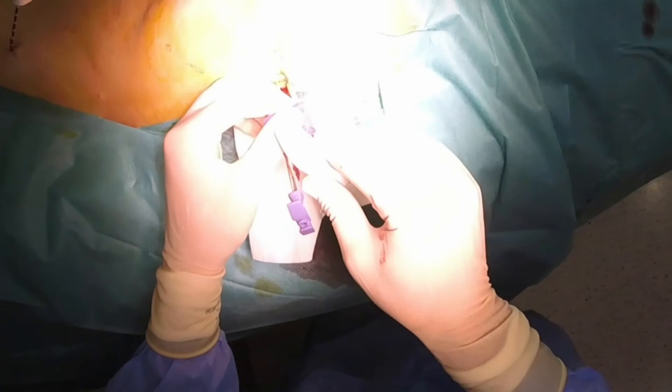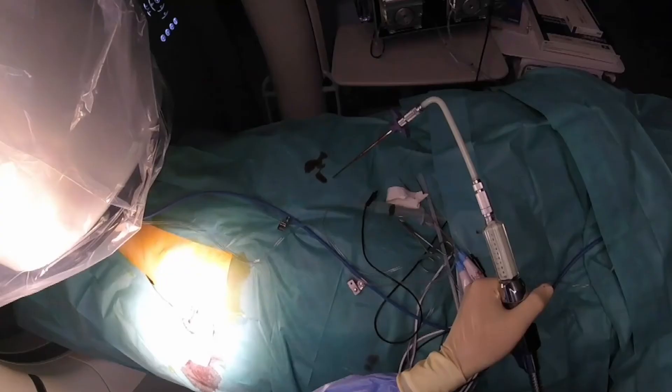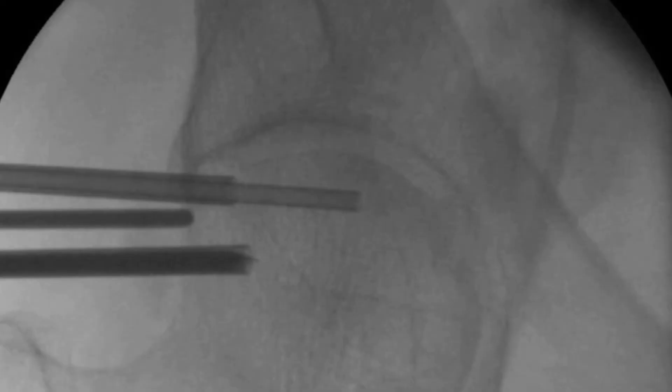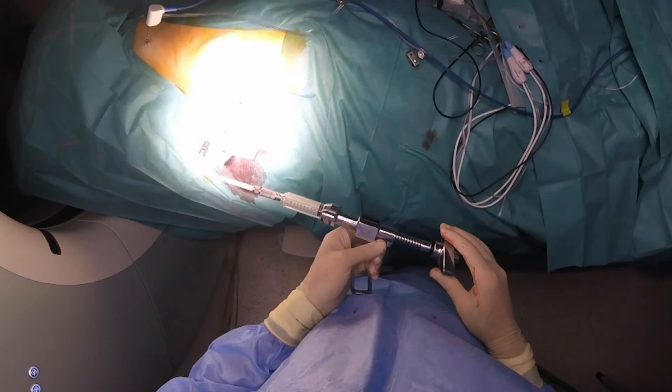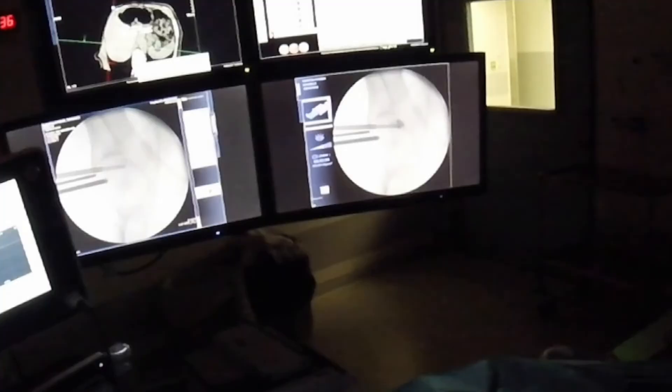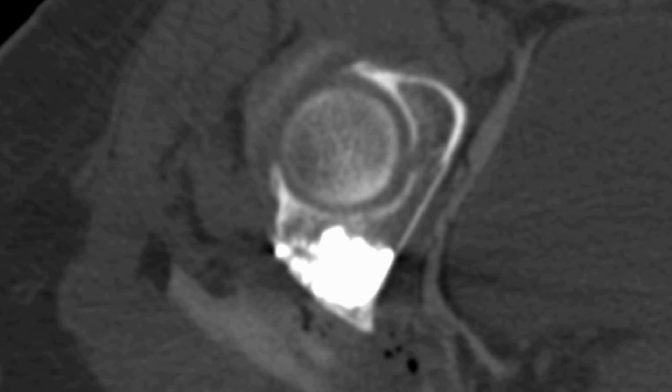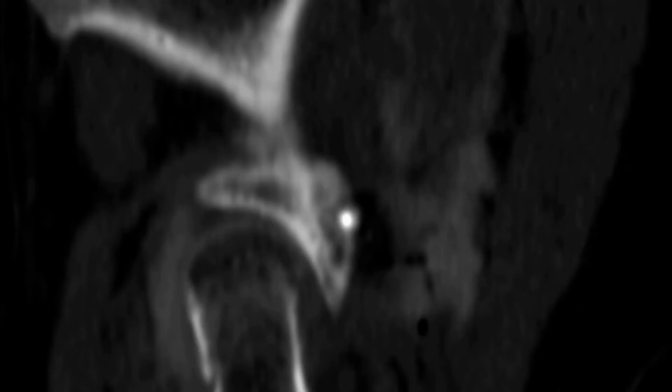Cement can now be prepared and injected. A standard PMMA bone cement is used and injected with the help of the dedicated cannula that goes through the bone introducer. Cement is carefully and slowly injected under continuous fluoroscopic monitoring. Intermittent CT acquisition is also performed to check for the proper distribution of cement in the anteroposterior axis. Once the ablated area is completely filled with cement, all devices are removed. A final CT acquisition with MPR reconstructions shows proper distribution of cement in the ablated area.